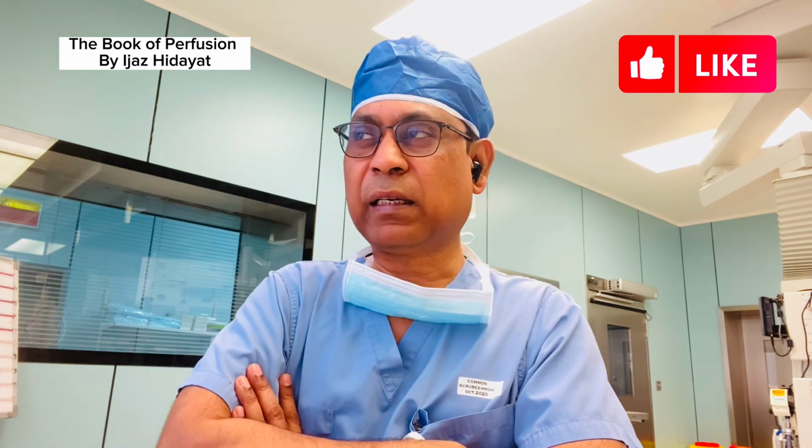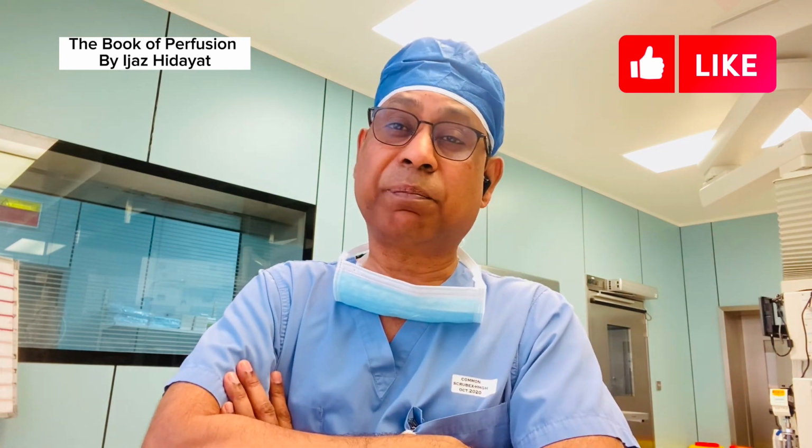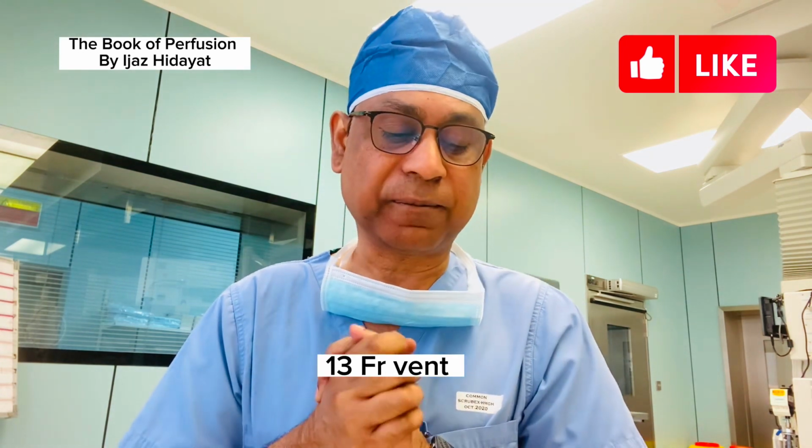To prevent pulmonary distension from the pulmonary hypertension, we use a PA catheter, PA venting, and the size of the PA venting is 13 French.